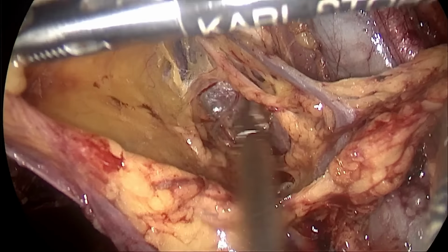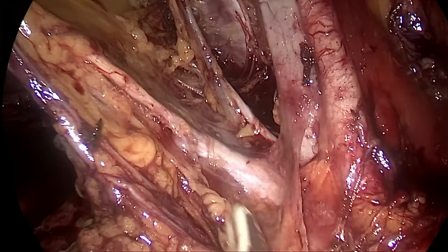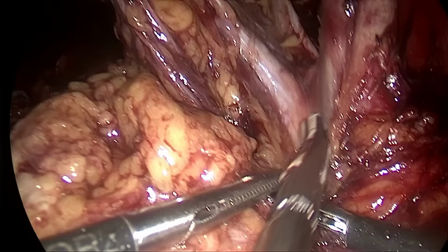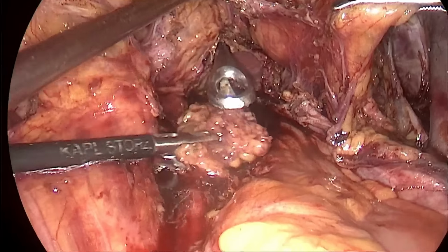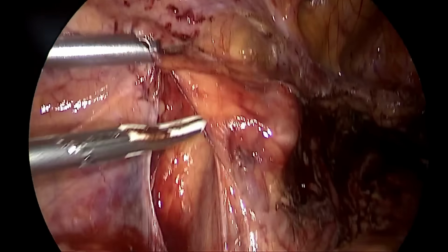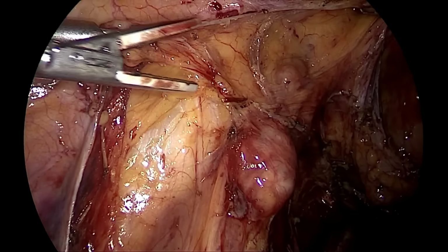So the lower limit of the pelvic node dissection is the obturator nerve, and the medial limit is the internal iliac artery that we can clearly identify here. So now we are at the junction of the internal iliac and the external iliac artery. So that's the last part. So right side pelvic lymphadenectomy is complete. So after a wash, it was fine that there is no bleeding. So moving forward, on the left hand side, the same step repeats.